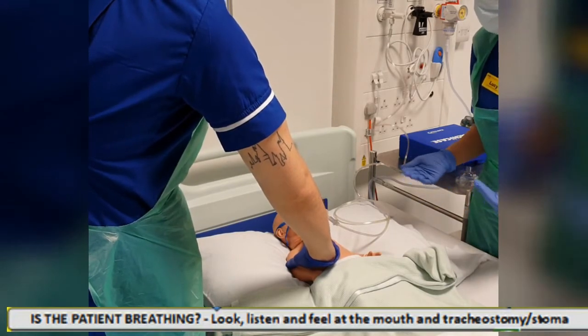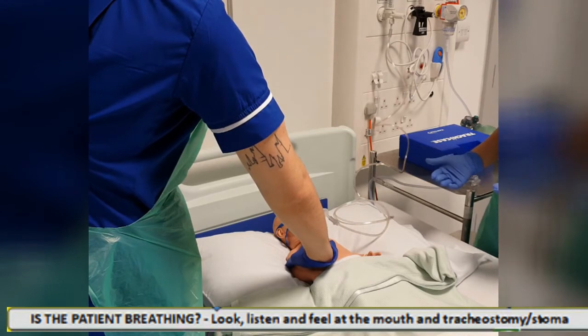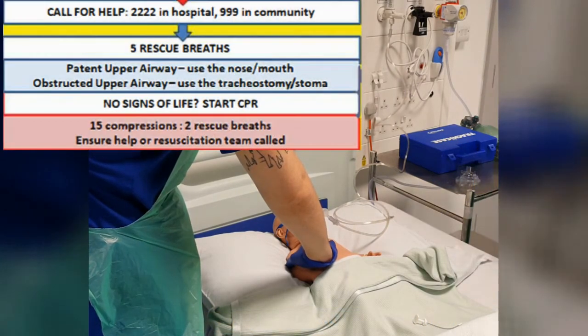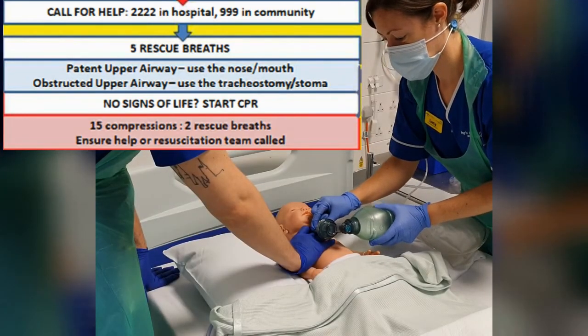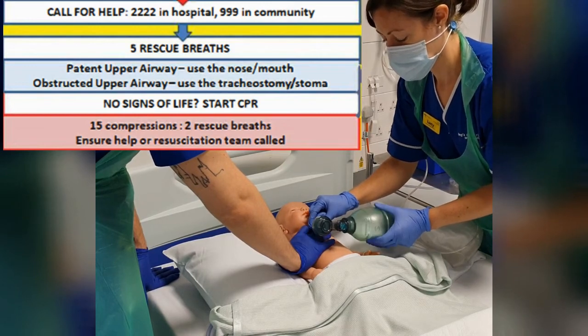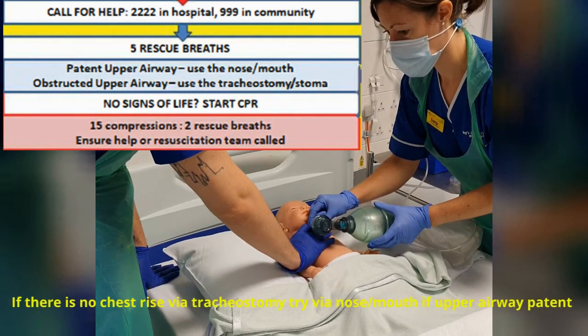I've just noticed that this patient's respiratory rate has slowed right down and they look like they're going to stop breathing. So we now need to move on to the life support portion of the algorithm. I'm going to give 5 rescue breaths using an ambu bag. As I'm doing the 5 rescue breaths, I'm checking for chest rise.